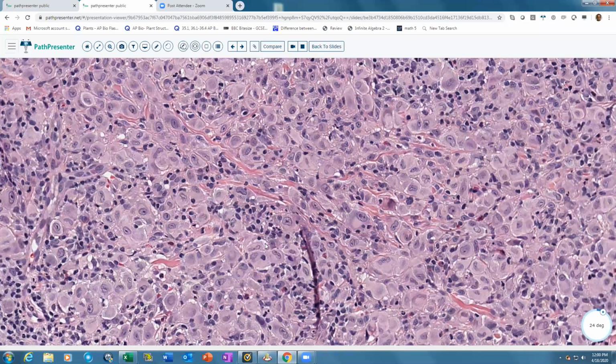This ground glass, sandpaper like cytoplasm that you see here is very, very characteristic of these large macrophages with a very big nucleus, often prominent nucleoli. Look at the cytoplasm here. Take a picture, put it in your brain, so that the next time you see these slides, that will always come to your mind. If you think about it, then you can make the diagnosis. If your mind doesn't think about it, you will never make the diagnosis.